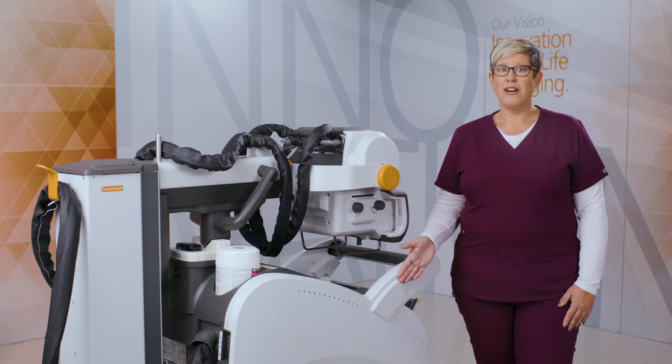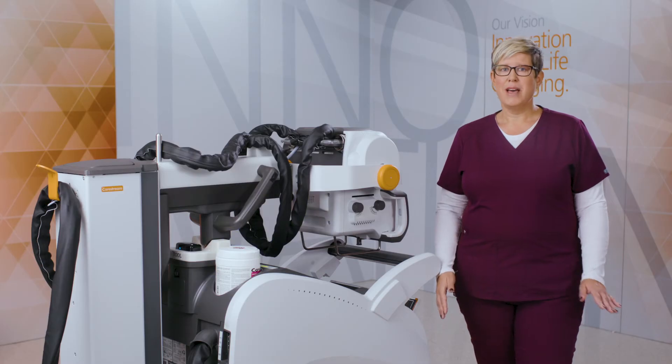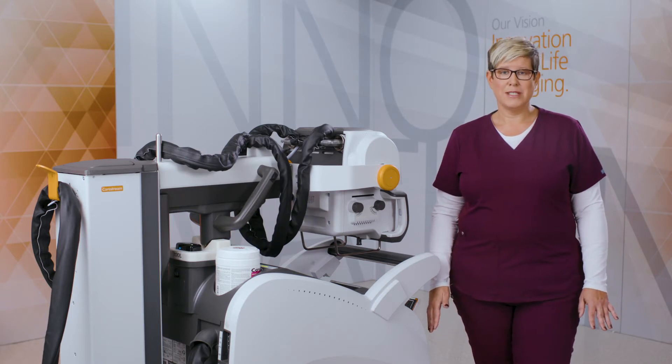With the swipe and go RFID option, a single swipe of your badge quickly allows you access to the system. It is compatible with most employee badges that use an RFID, but if not, CareStream will be happy to supply your facility.